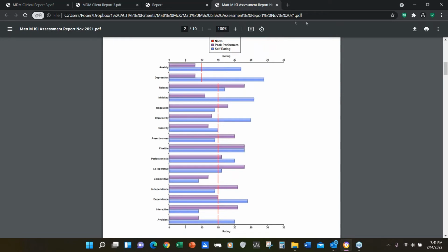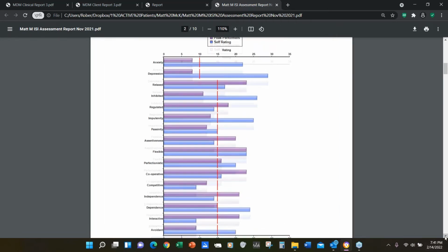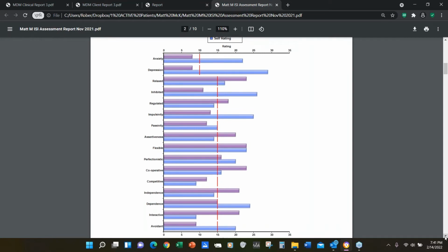But when it comes to relating to the conversation about the map, the physiology is the most important one. The CEC shows up when we begin the map conversation anyway. But I love the ISI, don't get me wrong, I always talk about it. But in terms of what we're here tonight talking about, how we talk about the map, the physiology guides me a lot.